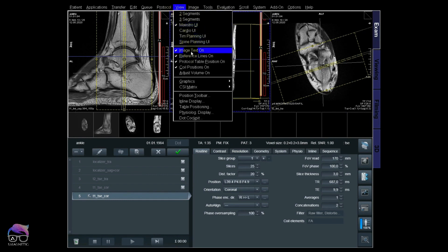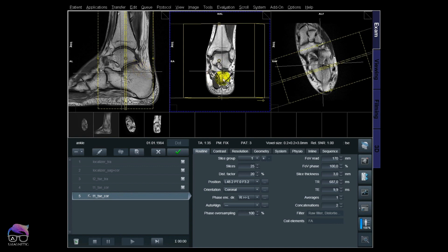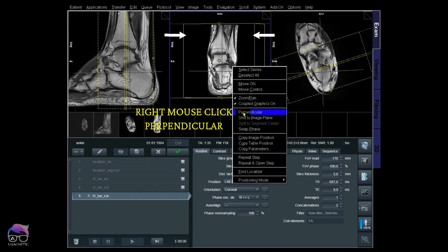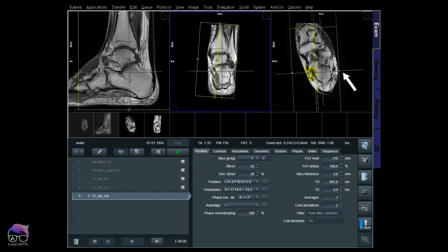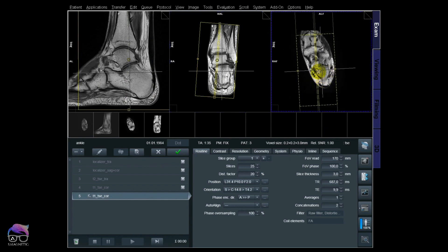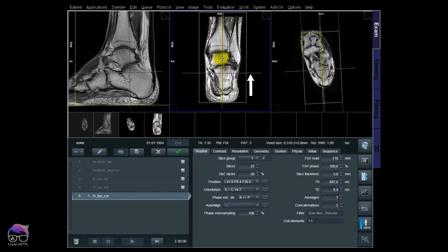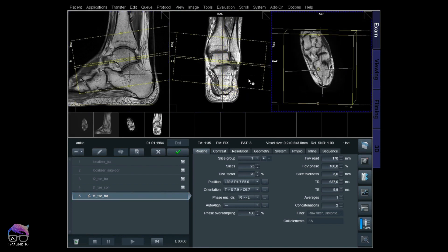Let's start with the sagittal. Whenever you're going to do a sagittal, do not activate the image window. What we do is activate the coronal and take the perpendicular tool — take a closer look at that arrow. Then we do a perpendicular on the transversal — take a closer look at that area. There you go! Now we are perpendicular on the sagittal.